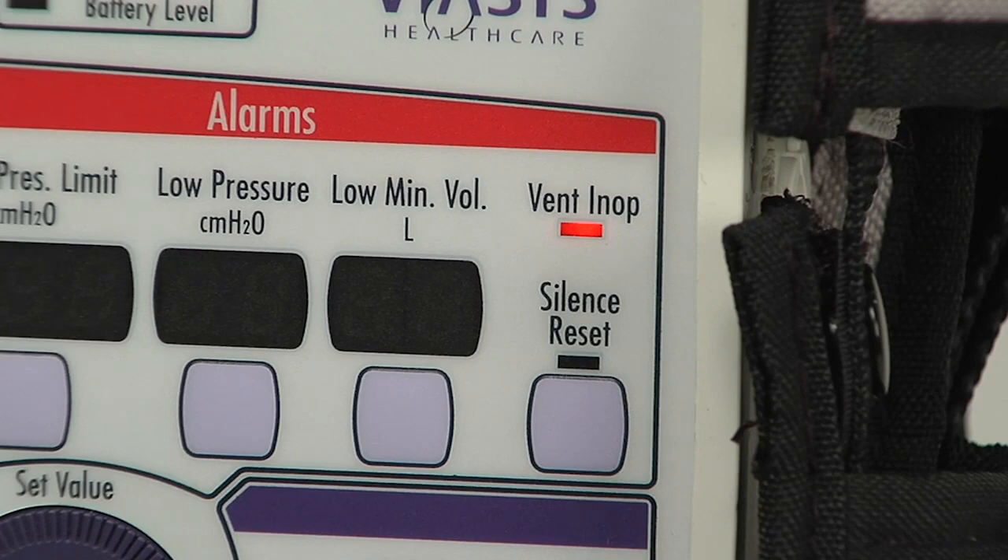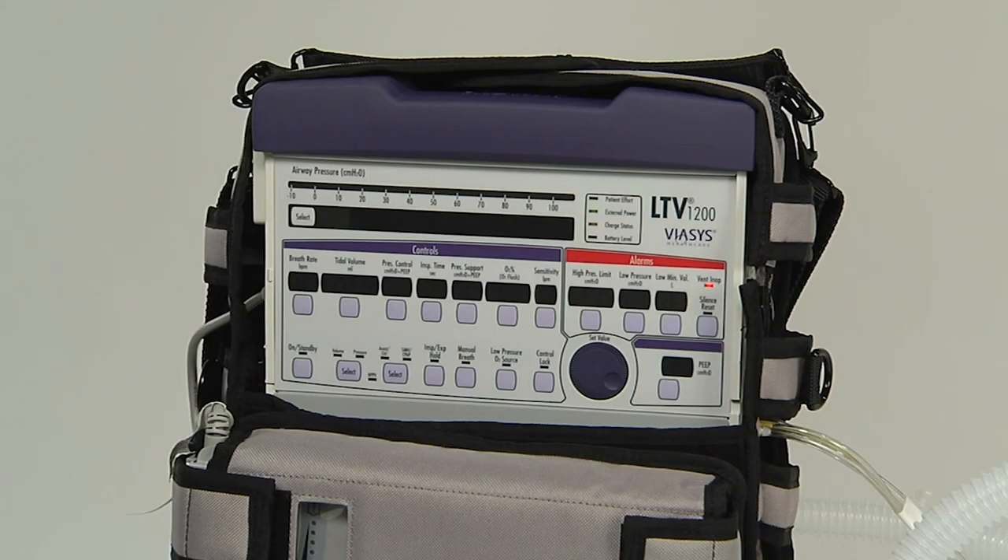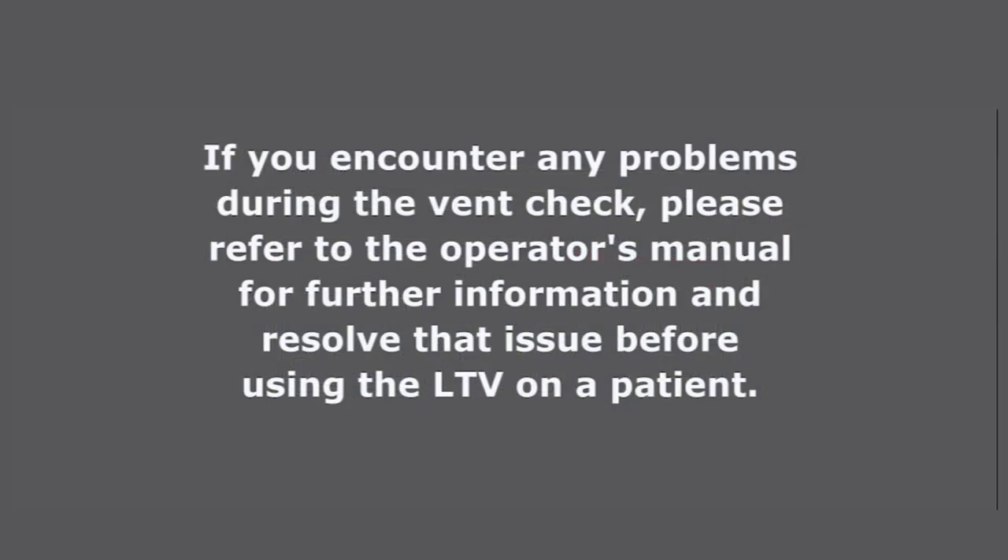You have now completed the vent check and alarm in op test. If you encounter any problems during the vent check, please refer to the operator's manual for further information and resolve that issue before using the LTV on a patient.